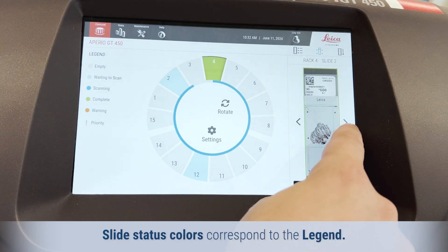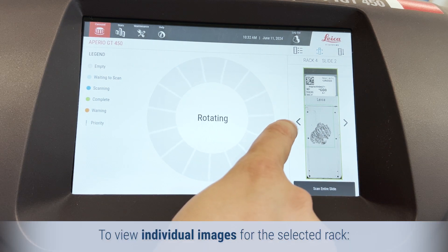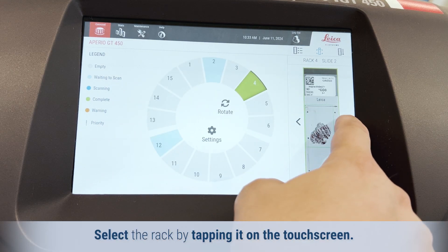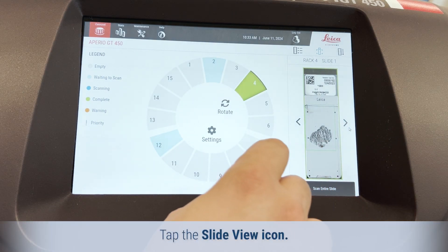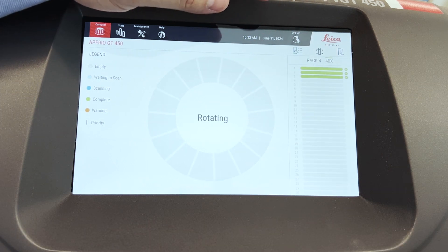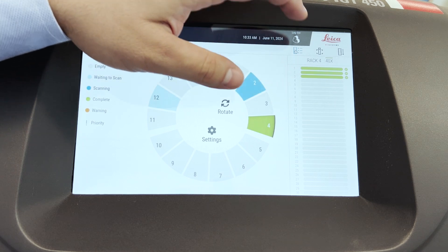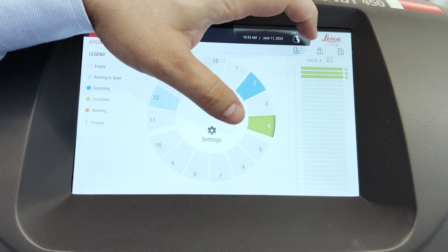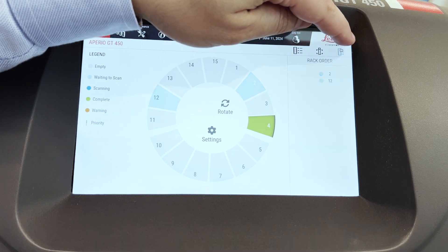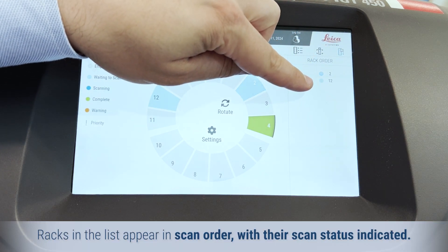Slide status colors correspond to the legend. To view the individual images for the selected rack, select the rack by tapping it on the touch screen, then tap the Slide View icon. To show the scan order of the racks, tap the Rack Order icon. Racks in the list appear in scan order with their scan status indicated.